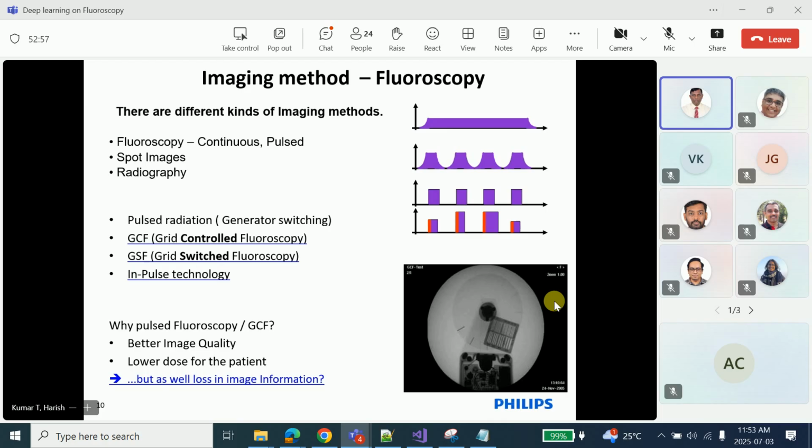Okay. The temporal resolution and all that. Sometimes in the procedure, it is not possible to repeat that instant. Once that instant happens, it's gone. So before it passes, you need to capture it. When I turn this, there is something which is very prominent, so I capture it immediately. Maybe that instant will not come back again. Or the flow of contrast. Once it has flowed, if you do not capture it, you have to give the contrast to the patient again.